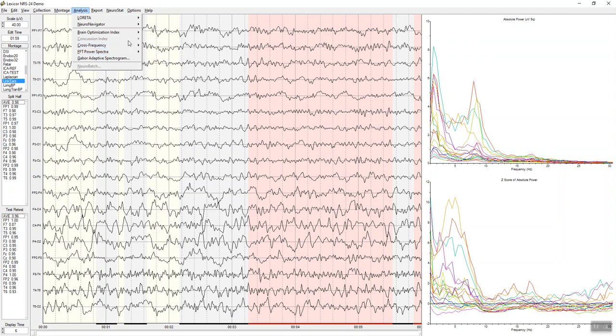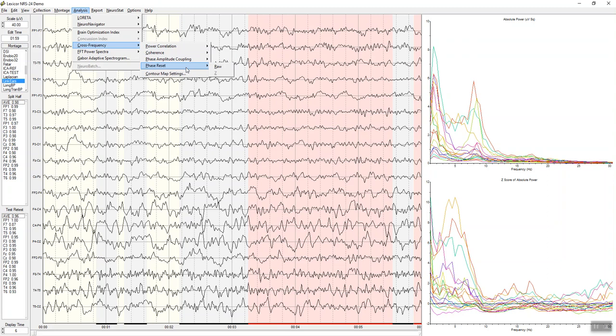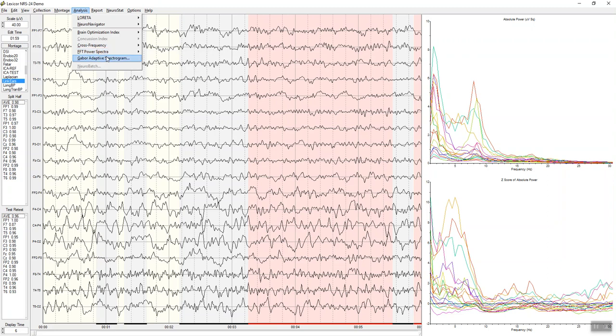There's a lot of cross-frequency programs available for power correlation, cross-frequency coherence, phase amplitude coupling both with Z-scores and raw scores, and then phase reset as well. Power spectra of various types can be computed and saved, as well as a Gabor adaptive spectrogram.